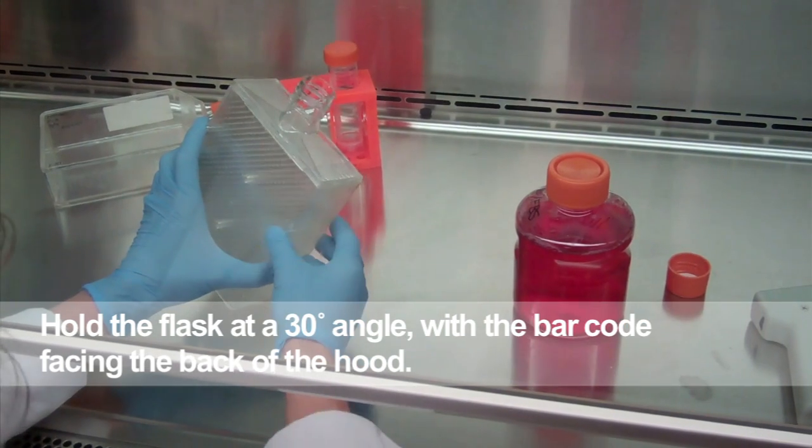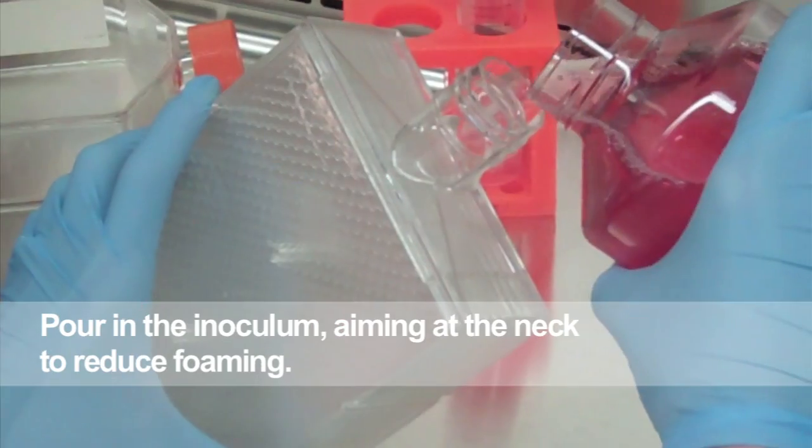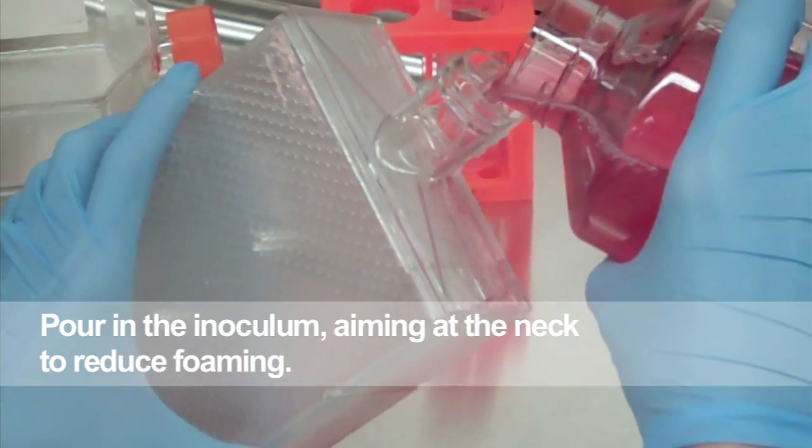When pouring, try to make as much contact with the inside of the flask neck to reduce foaming. You could also fill the entire vessel by using a 100 mL pipette.